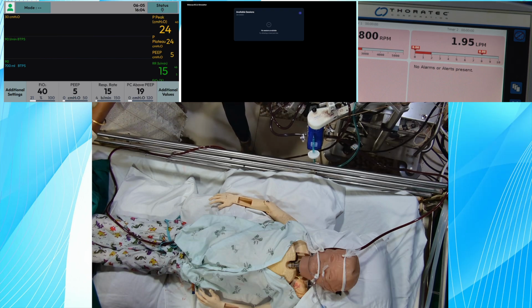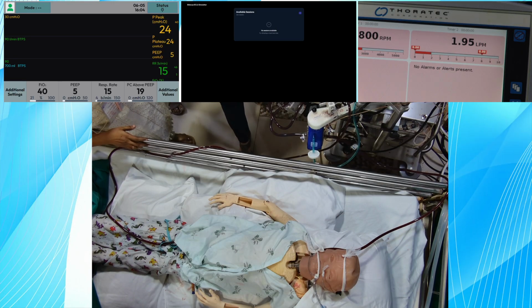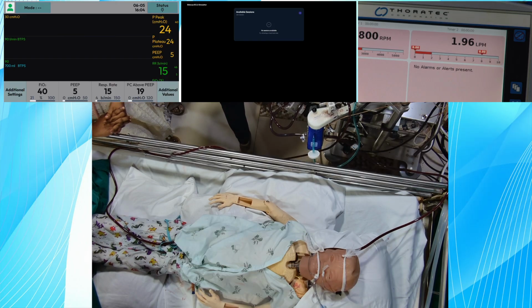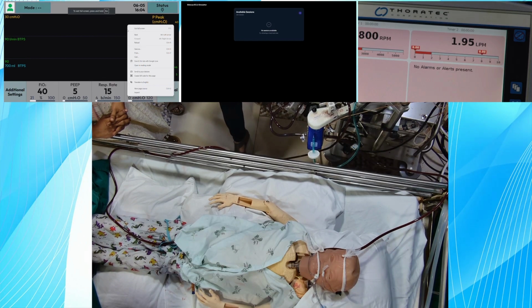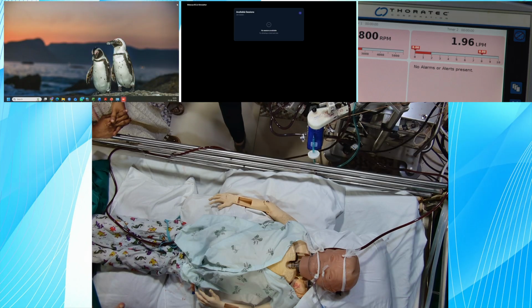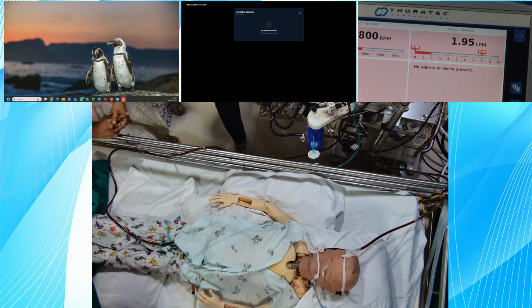The pressure has gone up? No, it is the same. There is no clot then, if the delta pressure is the same. So P2 is equal to P3, both are low. That means it has to be the blender. The blender we have already changed, but what happened we don't know. We have to wait for the monitor to come.